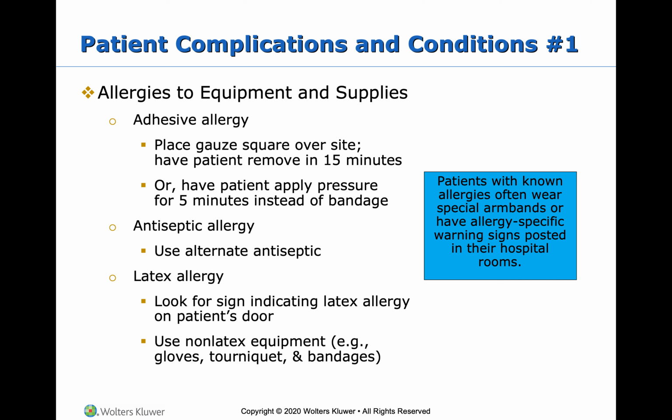Some people have allergies to betadine or chlorhexidine, the antiseptic that we use for blood cultures. It's important to know that we do have different types of antiseptics for if patients are allergic. I don't typically carry all of them on my tray, but I do carry betadine swabs, alcohol swabs, and chlorhexidine preps.